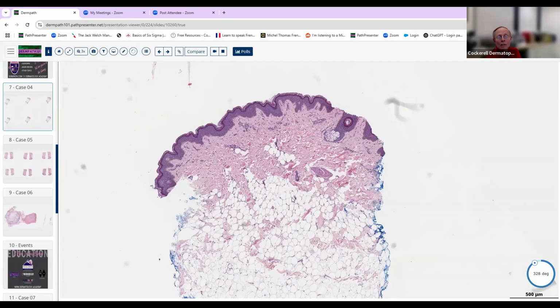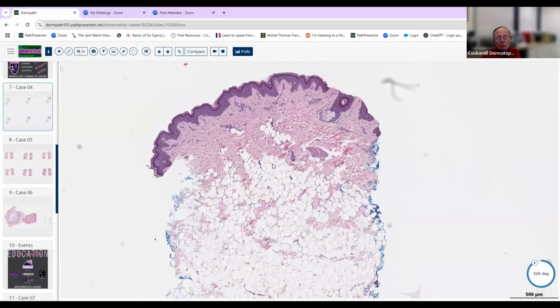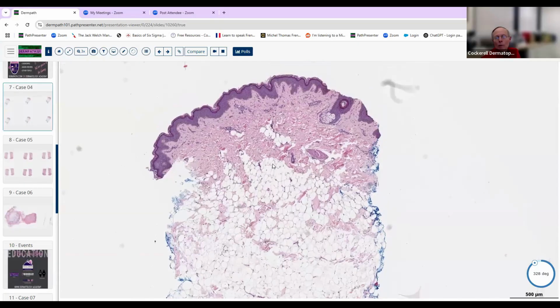They might have something like another tumor, another Peutz-Jeghers or something like that, and expect you to think that it's maybe a lentigo when the fat's clearly abnormal up here. They might say something like dyskeratosis congenita, just to make sure that you knew what the disease was, but this would theoretically be something that you might see with Goltz. So this was just an example of a fatty hamartoma, with some reticular dermal alteration.